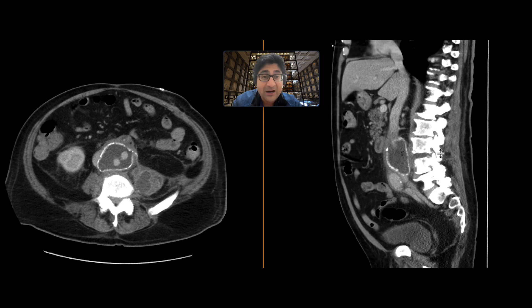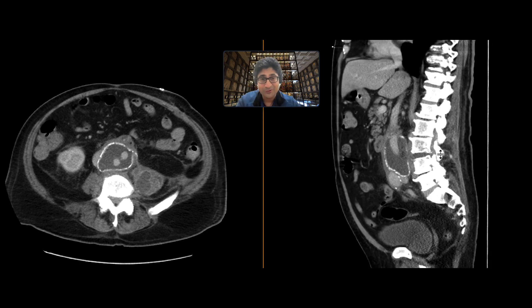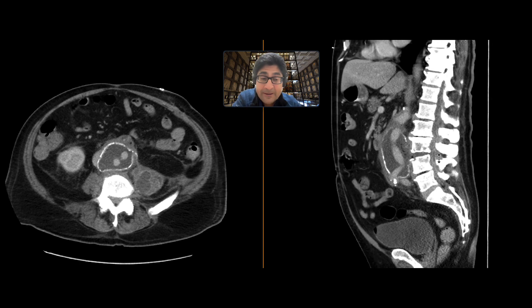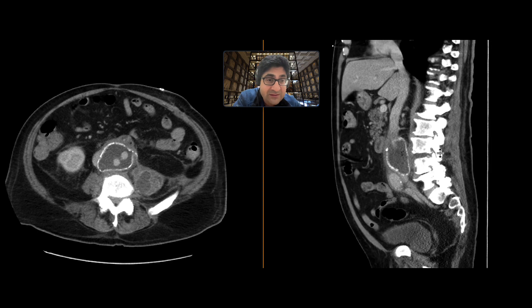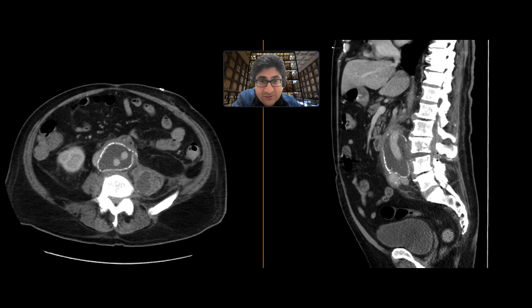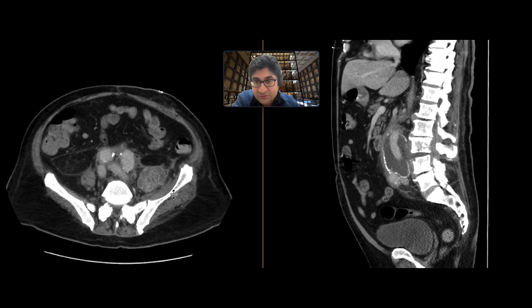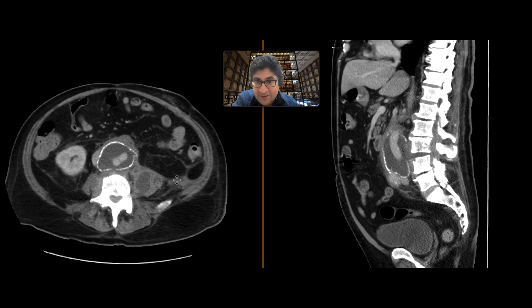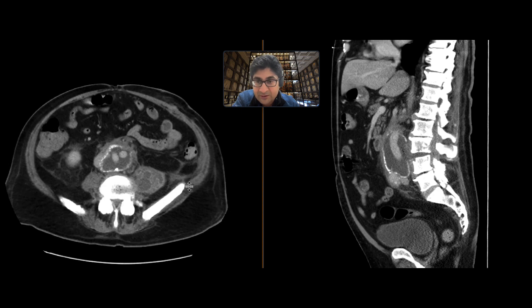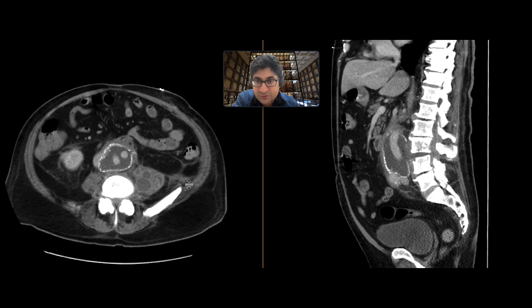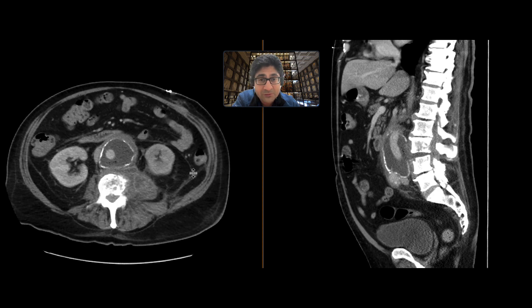These findings are highly, highly concerning for discitis and osteomyelitis. In this case, that has infected the graft, eroded a portion of the graft, and resulted in these psoas abscesses that are tracking downwards within the left psoas muscle.